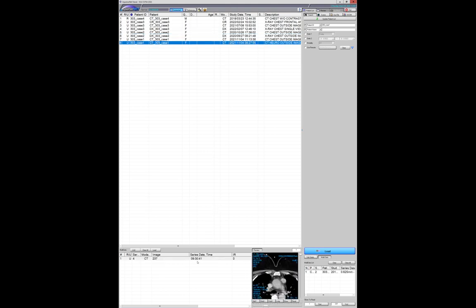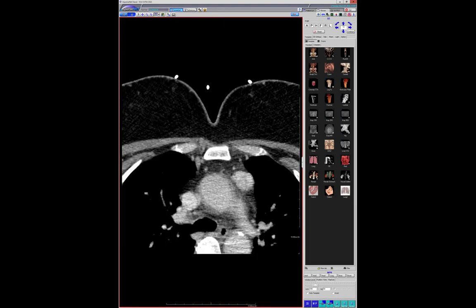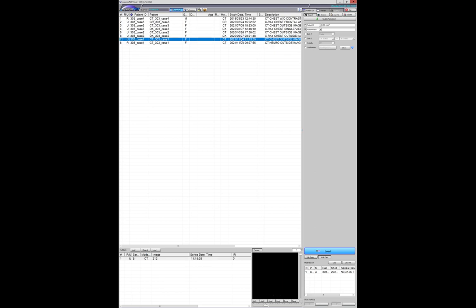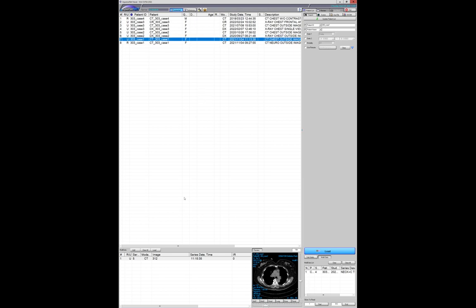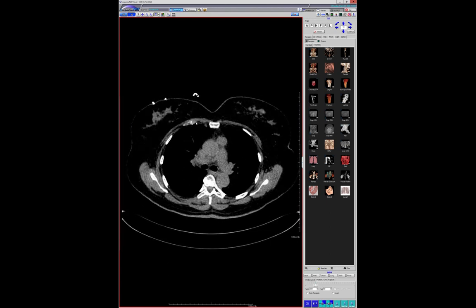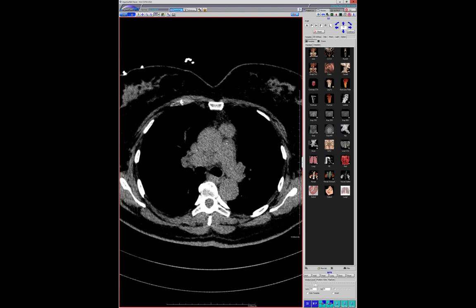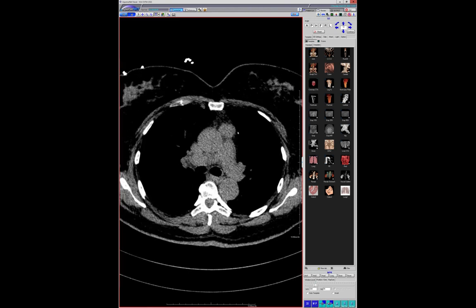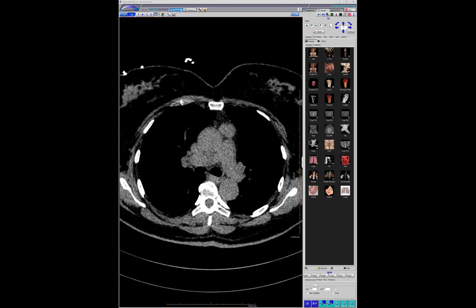I thought this was really interesting. This was an incidentally discovered vascular — or at least enhancing — mediastinal mass in the anterior mediastinum on a neck CT. The contrast-enhanced chest CT is missing, but the contrast-enhanced chest CT would show what the neck CT hinted at: this was a very avidly arterially enhancing lesion. I'm very upset that it didn't come across.